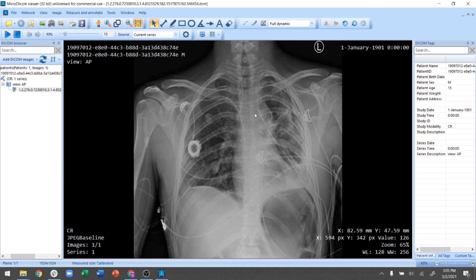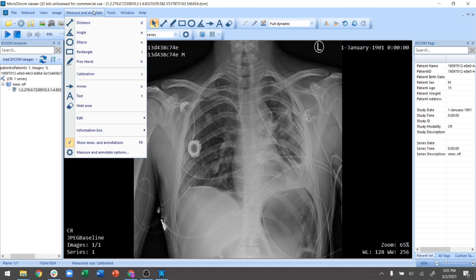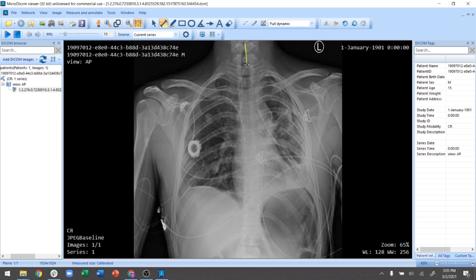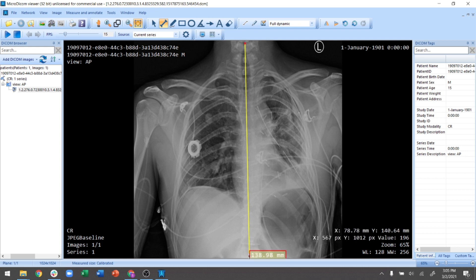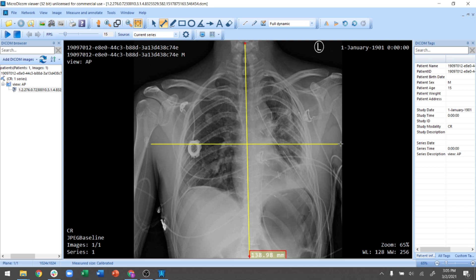This is the DICOM browser — based on where your cursor is, it tells you the X and Y location. An important feature is the calibration tools. For example, you can measure how long the spinal cord is — in this case it's 138 millimeters — or how wide the chest cavity is that you're analyzing.